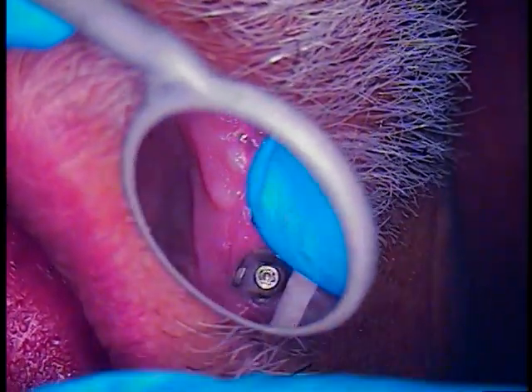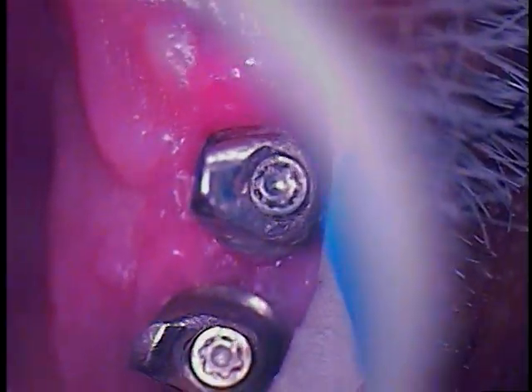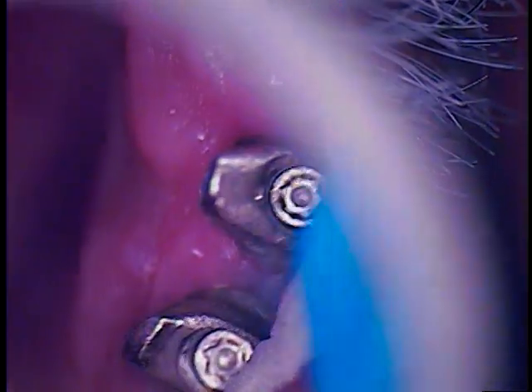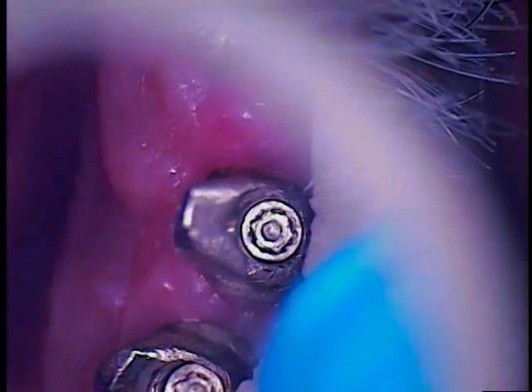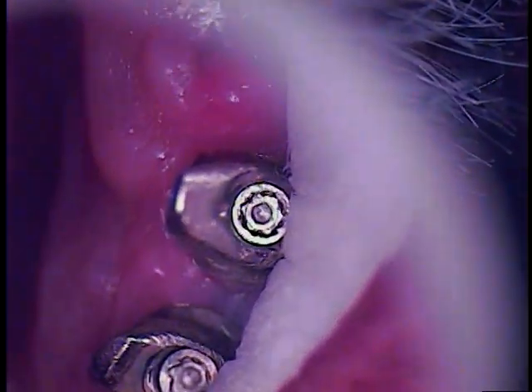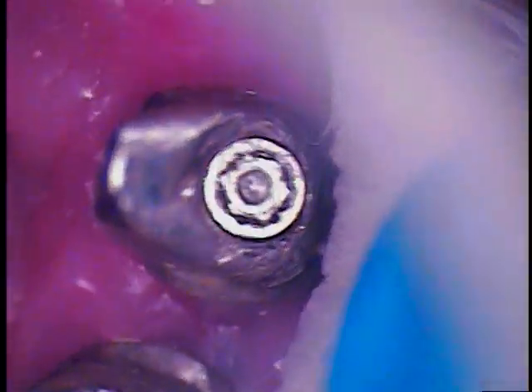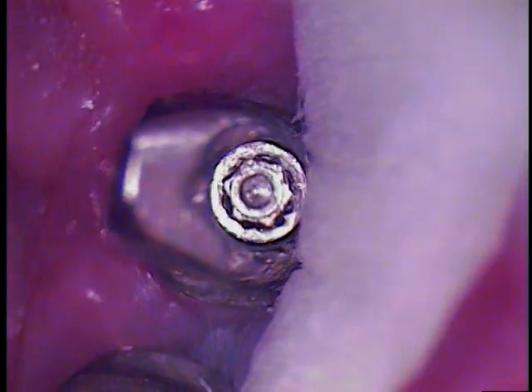But even before that, we're going to pre-soak this with what's called Tartar and Stain Remover. This is for dentures and it breaks up any bio-burden and any calculus formation. Tartar and Stain works great on dentures and hybrids, and cleans tartar. So we're going to put just a single drop of that in there.